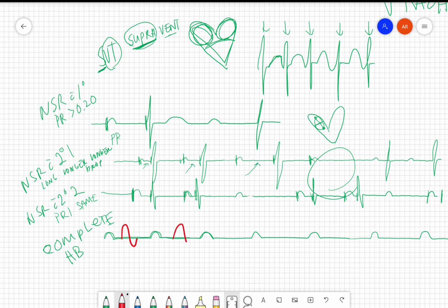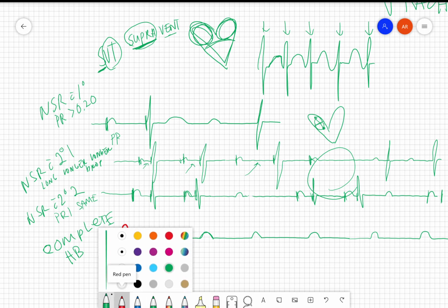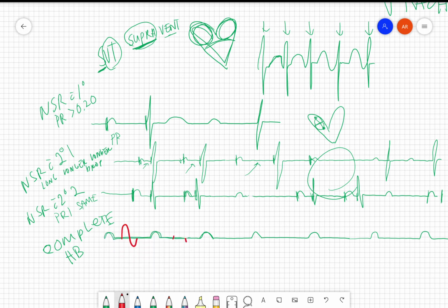No, I don't want to draw that there. Let's just erase that bad boy. Go back to my red. Okay. Instead, we'll draw it here, and here, and it'll come here, somewhere in there. Okay, so what would this actually look like? Let's go like this. It would look like this. This is probably going to look bigger because it's going to be both of them together. And this will look like that. So they'll kind of merge together in some places. I tried to draw this as best I could.